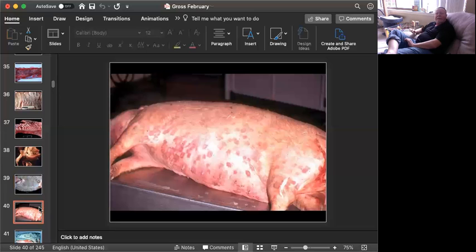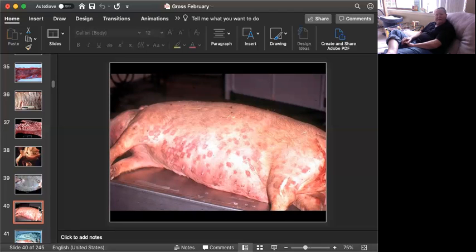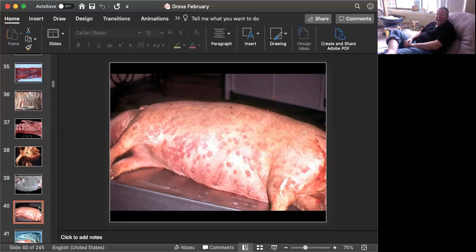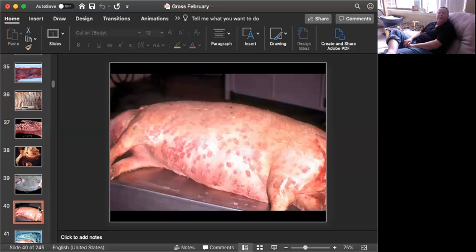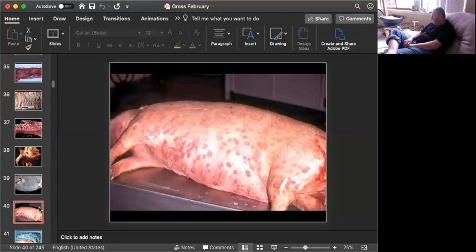Okay, slide number nine is tissue from a pig. Can you give me a morphologic diagnosis? Hint, hint. How's your short-term memory? And a cause. Okay, time's up.